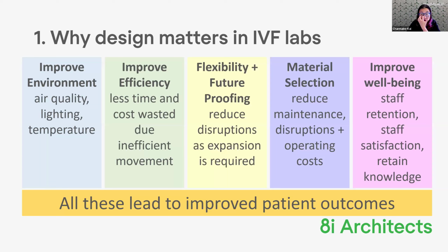Material selection, we'll talk about material selection. If you have good, robust material selection, it will actually reduce maintenance within your lab. It will also minimise disruption and operating costs within the lab in terms of building it.